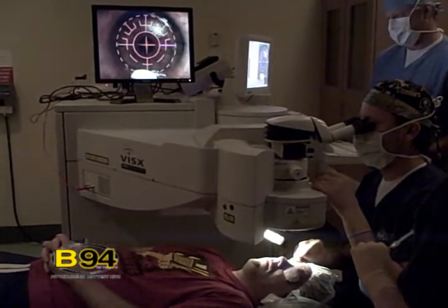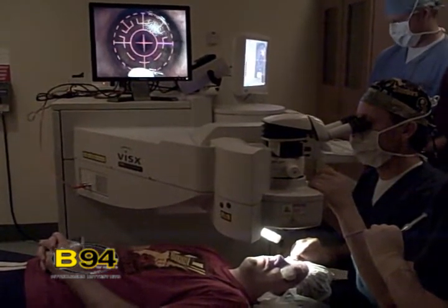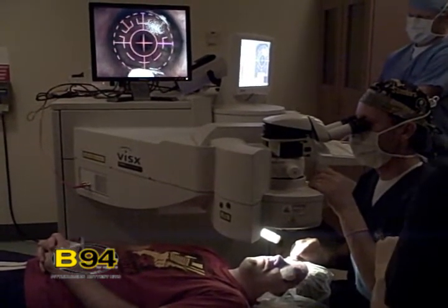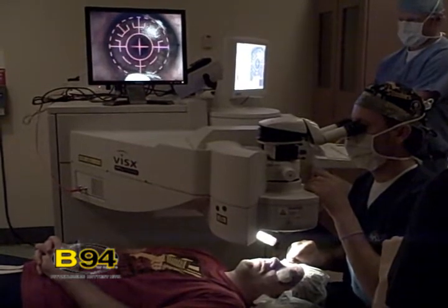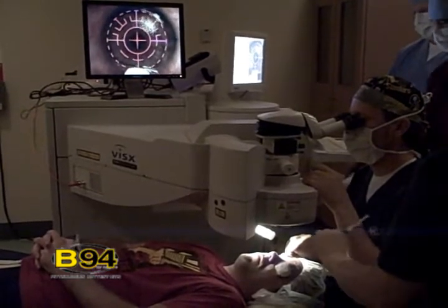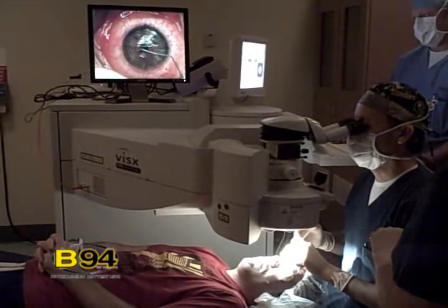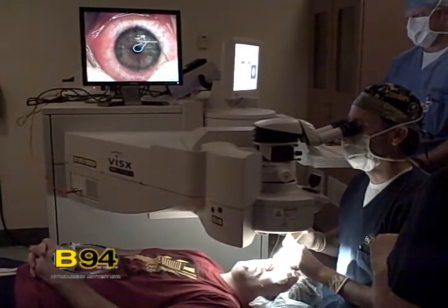Now it's a white light but I need to stay focused straight ahead. I'm just going to get the flap back to bed, back where it originally came from. You'll feel a little rinsing here. A little wet. Surgery's all done. You've been great. Congratulations.